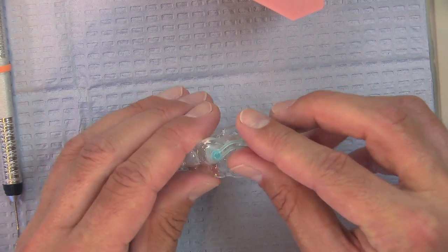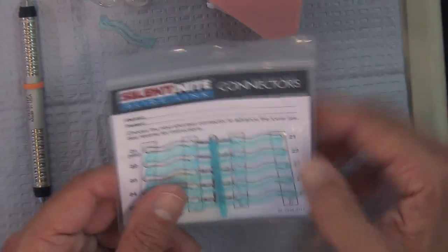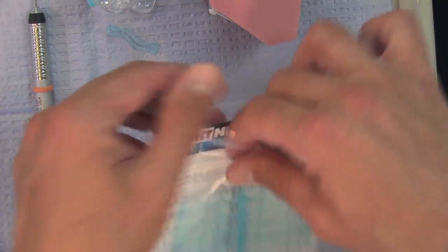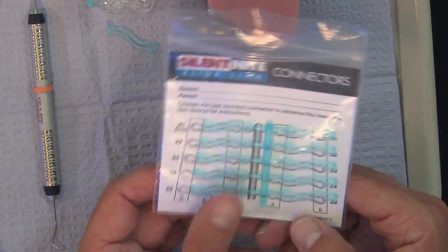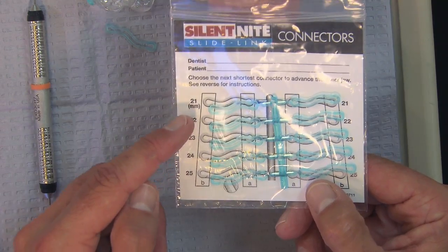You can give them the connectors and they're able to take these home and take it off and replace it. So we actually send the patient home with a package like this one. And you can see we've got some measurements here. It starts with a 25 millimeter connector and then 24, 23, 22, 21.